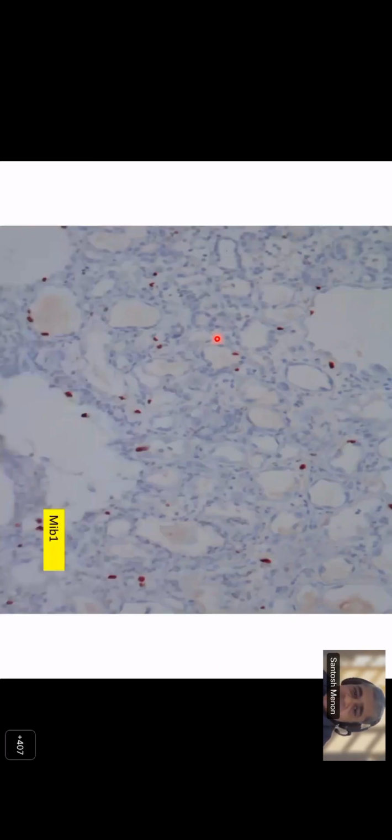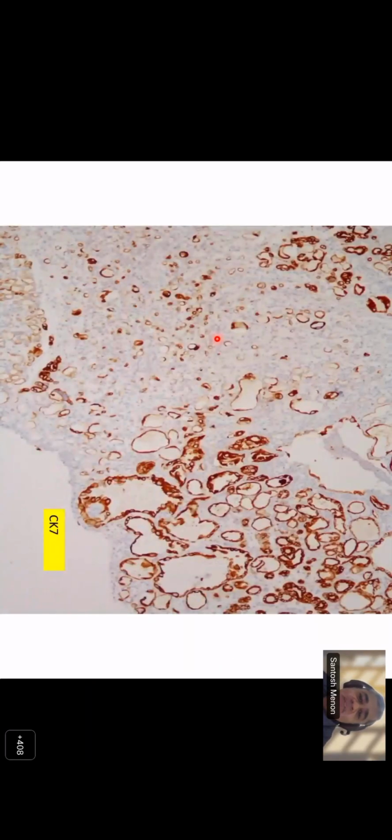Nephrogenic adenoma per se is not a rare thing to occur in the urogenital tract. It is usually related to instrumentation, long-standing inflammation, cystitis. They can all cause the formation of nephrogenic adenoma. Generally, you have a papillary, tubular, and tubulocystic appearance. But very rarely, along with this tubulocystic and tubular appearance, you can have a signet-like appearance. So mind you, if it was purely signet, we would have been really foxed. But thankfully, even in this morphology, you can see that several of them are actually tubules.